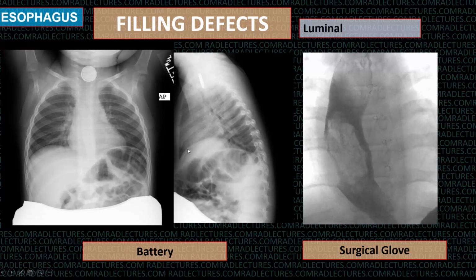So therefore presence of a battery is an emergency for removal. Food or surgical or soft things can appear like tumors almost in the esophagus.